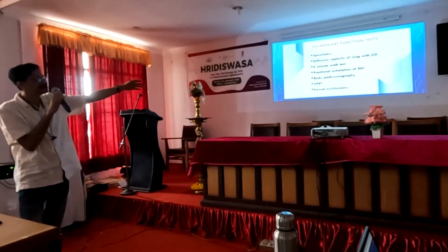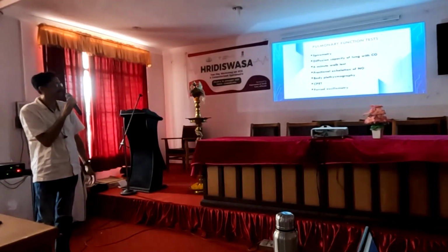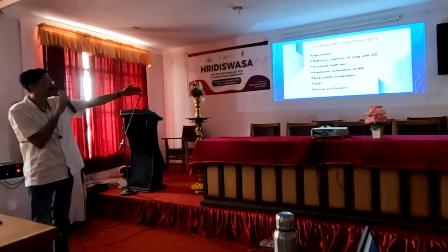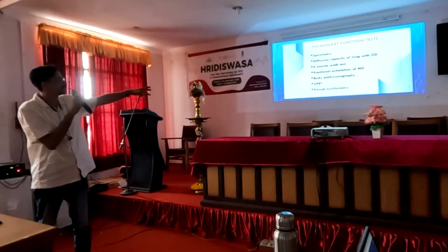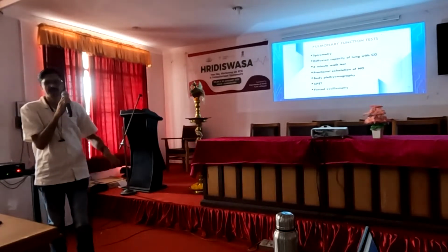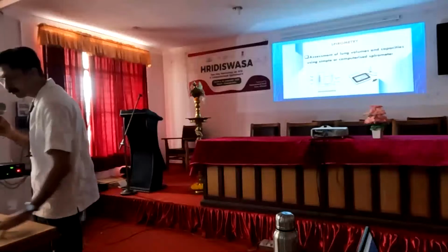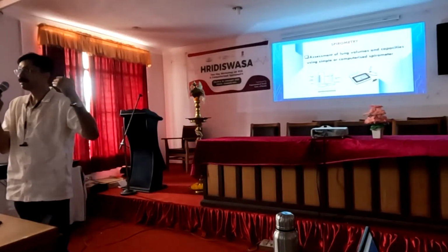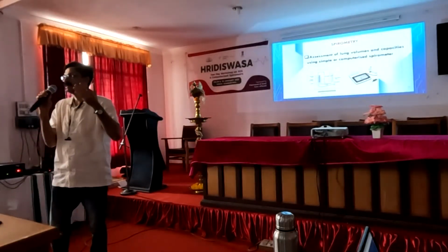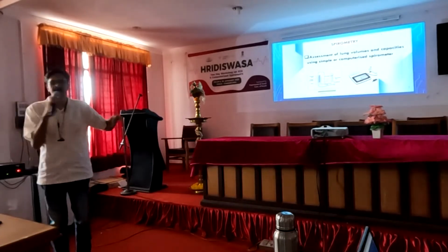Common pulmonary function tests include spirometry, diffusion capacity of the lung with carbon monoxide, the 6-minute walk test, body plethysmography, and the cardiopulmonary exercise test. Among these, our topic, lung volumes and capacities, comes under spirometry.